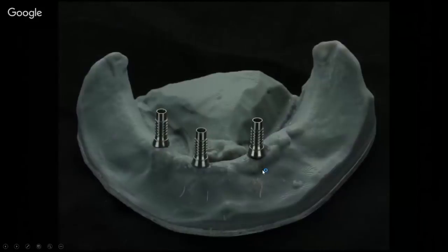And then beyond that, there's just so many possibilities. I wish I had 3 more hours to talk to you about some of this stuff, but I'm just going to give you a taste. This is an all-on-3 case, right? It's the new trend. Everybody's going to be doing all-on-3 next. Or it could just be that I was too cheap to put another analog in there and make an all-on-4 model. But nonetheless, the principle's the same.